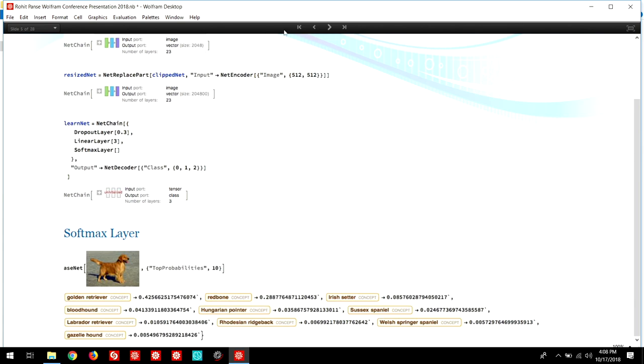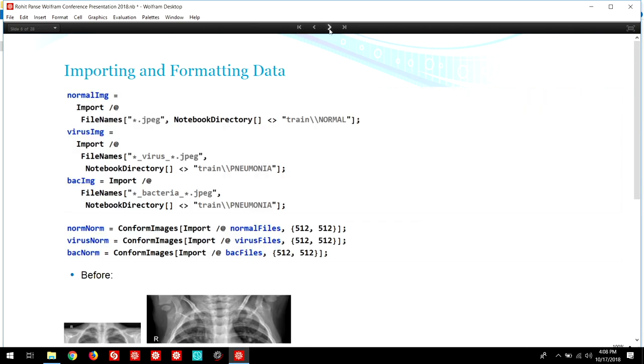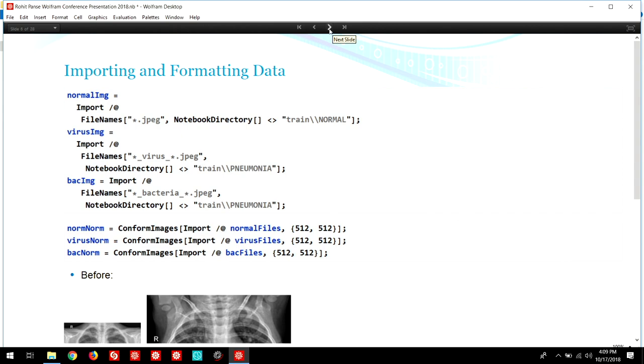The Kaggle dataset that I used had over 5,000 images when I downloaded it to my computer. I imported the files from their respective folders. The virus and bacterial pneumonia files were found in the same folder, so I used a simple separating sort tool to organize only the images of a certain class to their corresponding variables. I conformed the images to have dimensions of 512 by 512. I did this because I specified in the input layer to take images of only those dimensions.